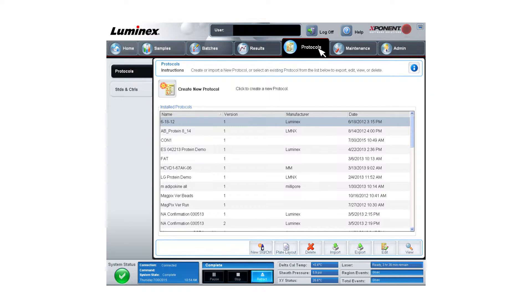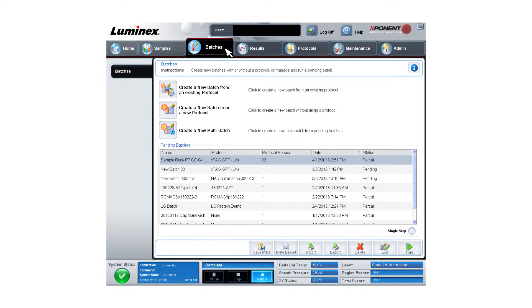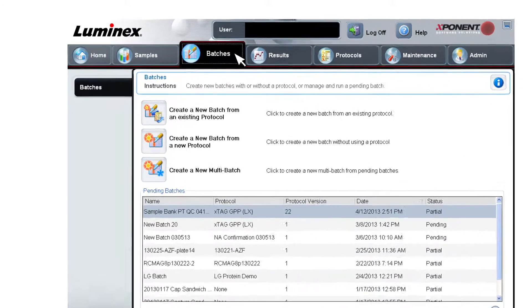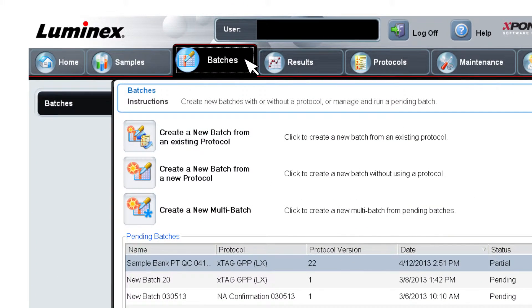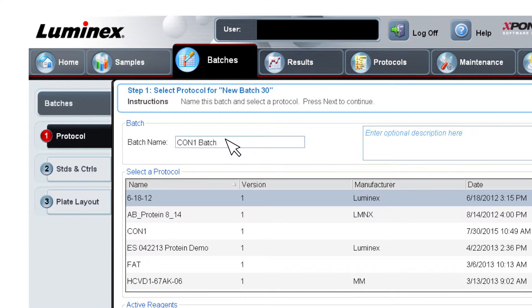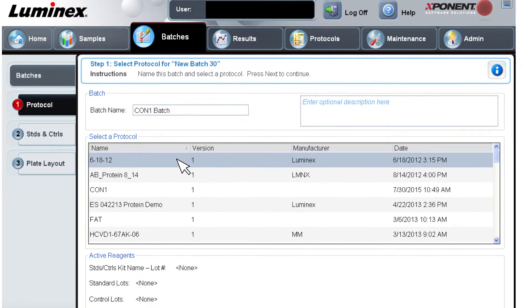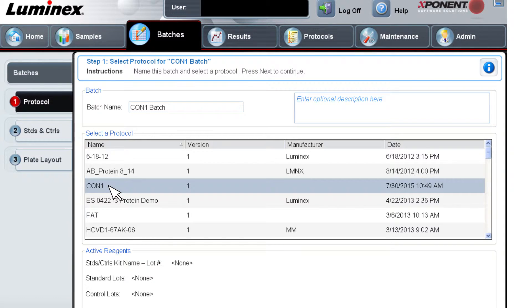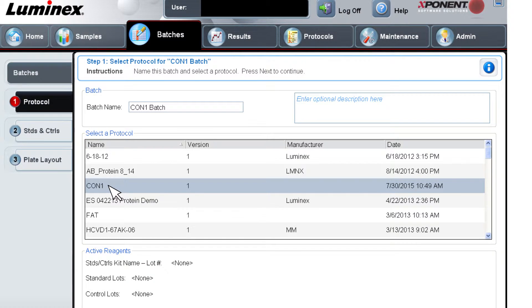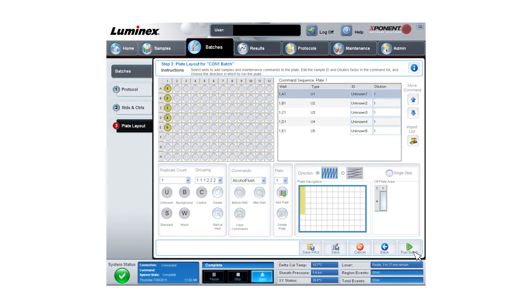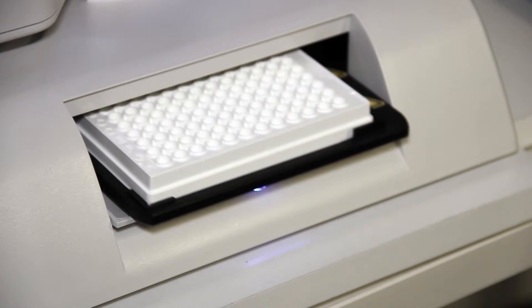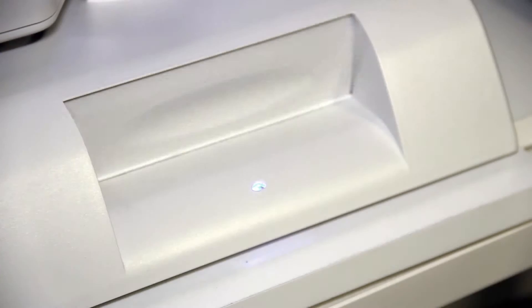The next step is to create a batch. Navigate to the Batches page in Exponent and click on the Create a new batch from an existing protocol button. Select the correct protocol from the list of saved protocols. Load the plate into the XYP and click Run Batch.